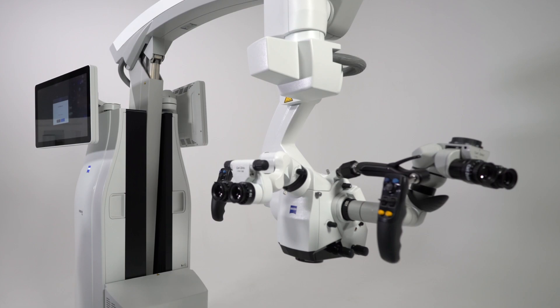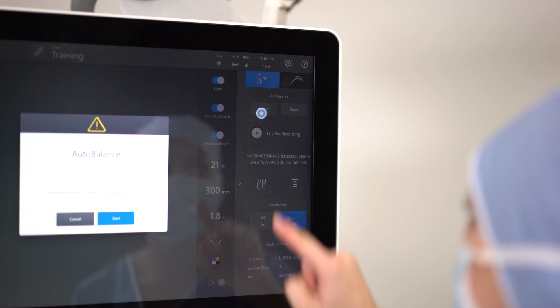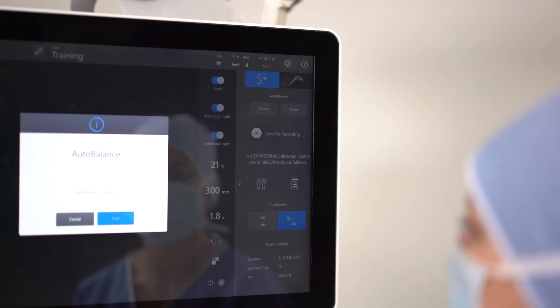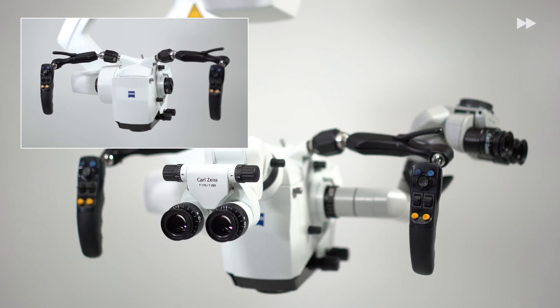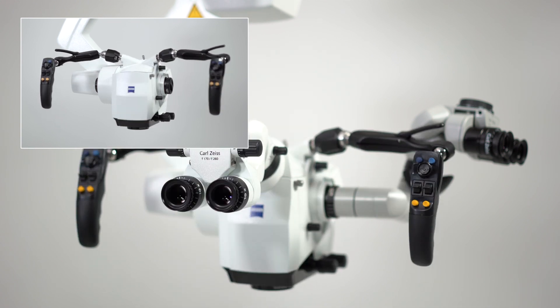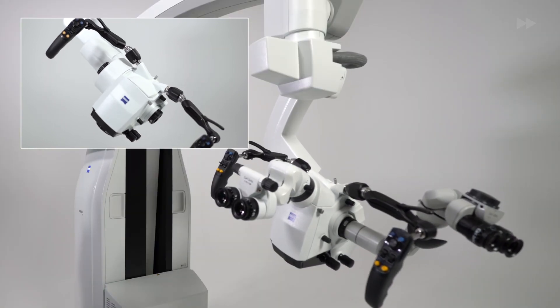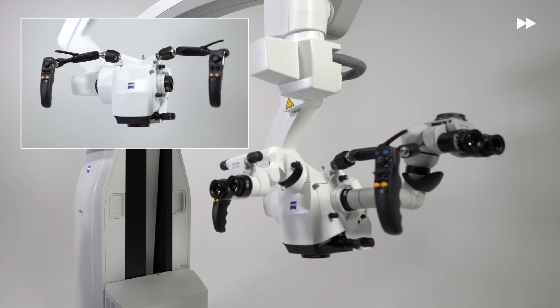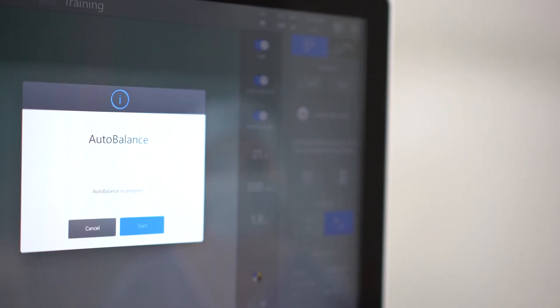Ensure the Zeiss Kenevo 900 is balanced. To start the balancing, simply press the button Auto Balance System on the user interface. The device balances itself along all microscope and stand axes, enabling easy movement during the surgery. To finish Auto Balance System, press Done.